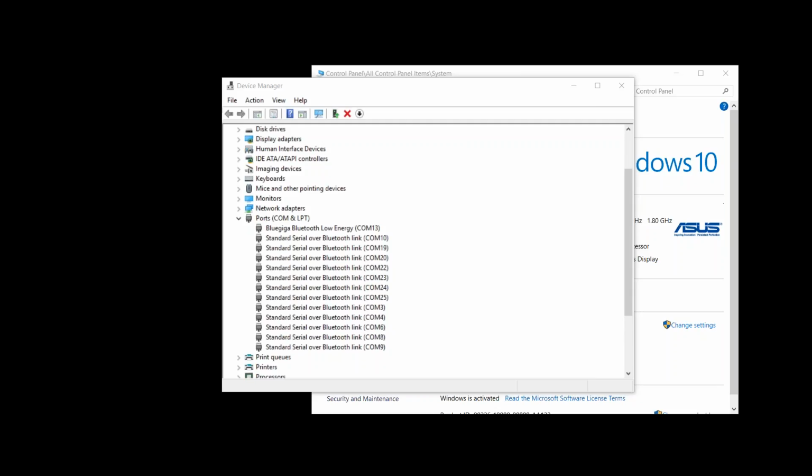Yeah, for cycling, it's basically that you set the baseline, and then the resistance will increase every 2 minutes. I think it's 30 watts and until exhaustion. But yeah, instructions are coming.